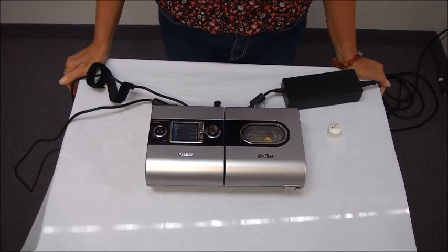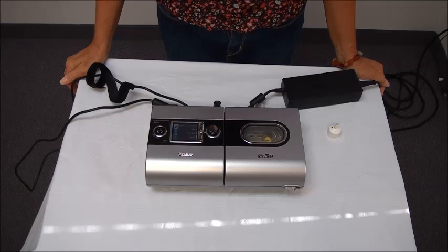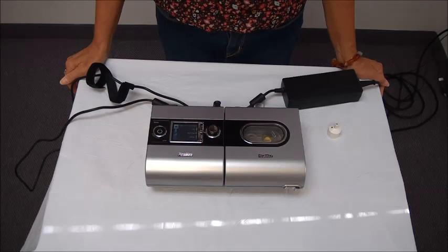Hello, I'm one of the respiratory therapists from Midwest Medical and today we are going to go through the operation and use of the ResMed S9 CPAP or BiPAP machine.